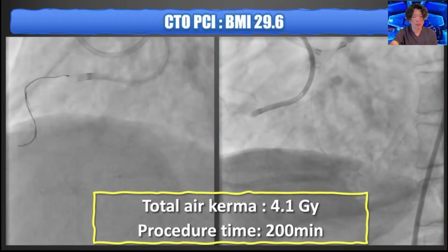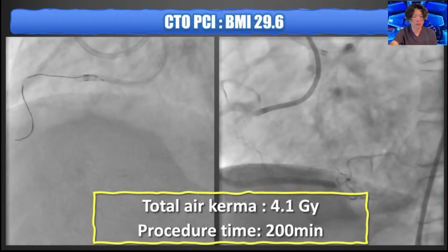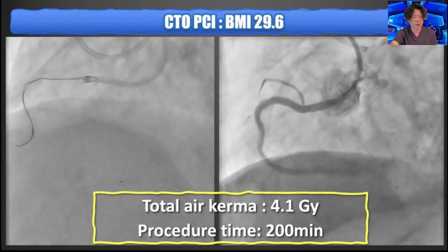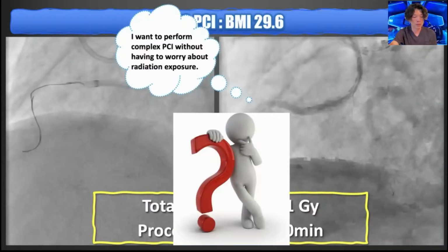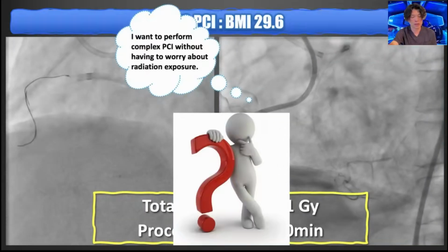Given these realities, a common clinical question arises: I want to perform complex PCI without having to worry about radiation exposure. Is there any effective way to achieve that? In this presentation, I aim to answer that exact question.